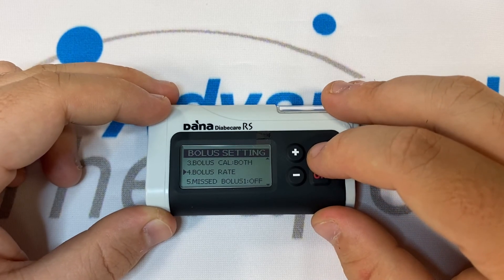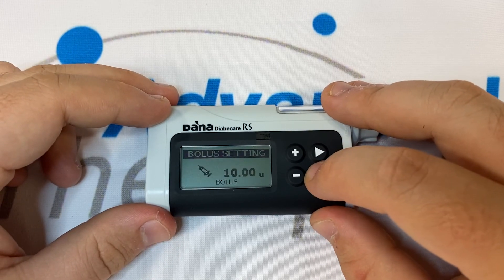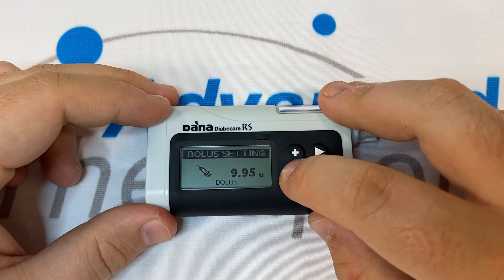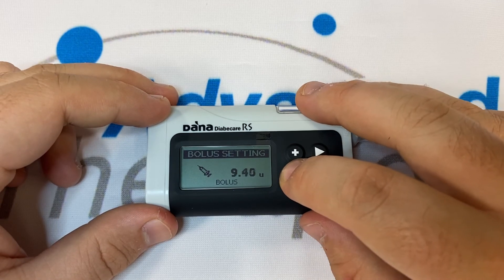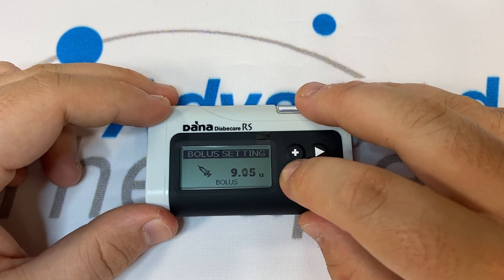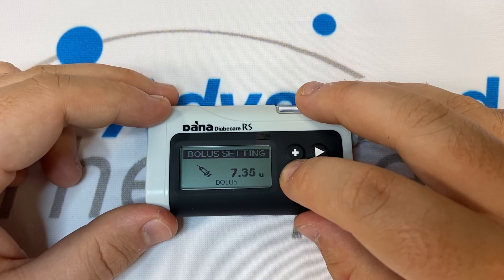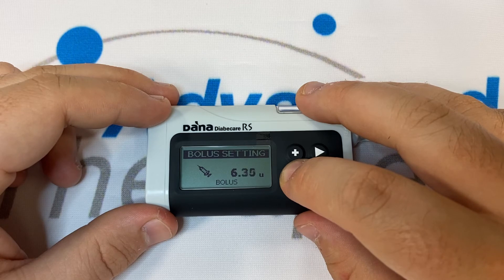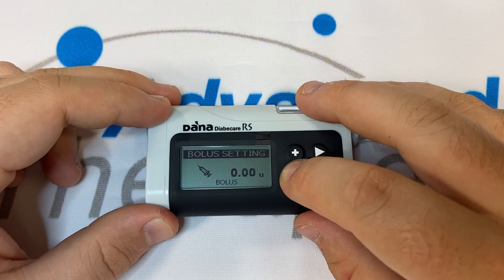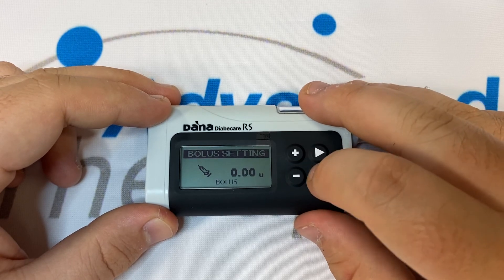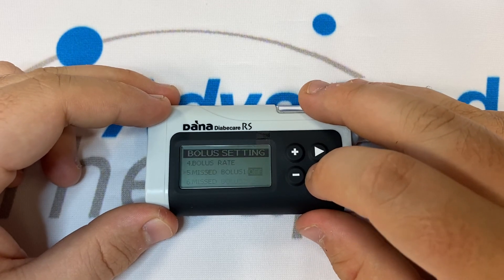Number four is bolus rate. Press OK on bolus rate and set this number down to zero. This number acts as a default number for manual bolusing, and for safety reasons we'd much prefer it to be set to zero so there's no chance of accidentally bolusing an increased amount. Press OK and OK again to save.